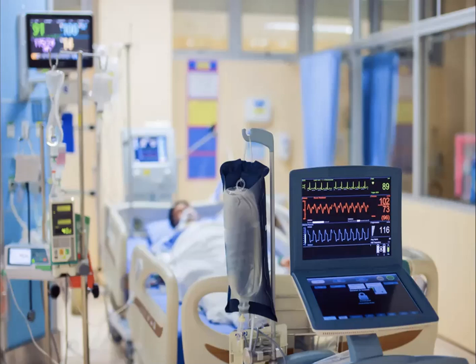Obviously, in a hospital environment, we want the alarms to be alerting. We want doctors to give attention to these and make sure they don't just disappear into the background. So the question we're exploring here is whether there's a way we can make them just as alerting and just as informative, but less annoying, so they're not as problematic from a patient care perspective.